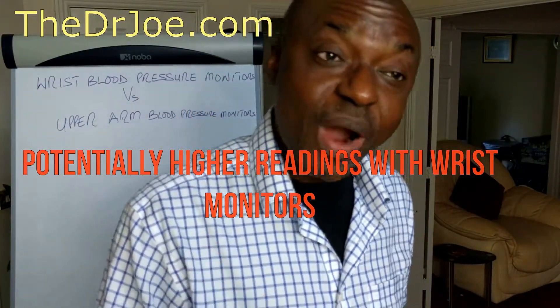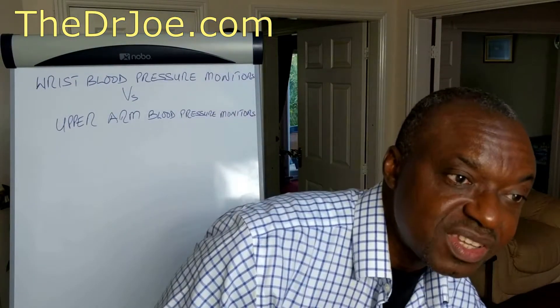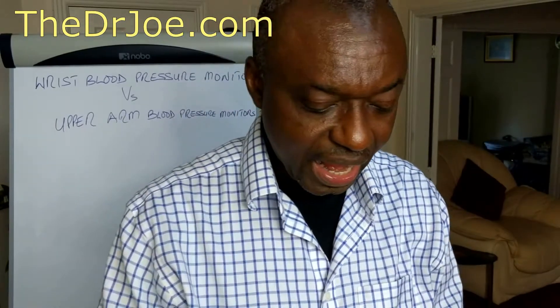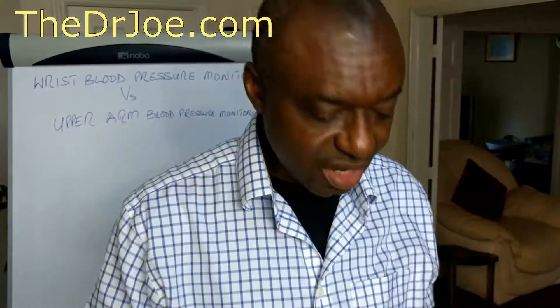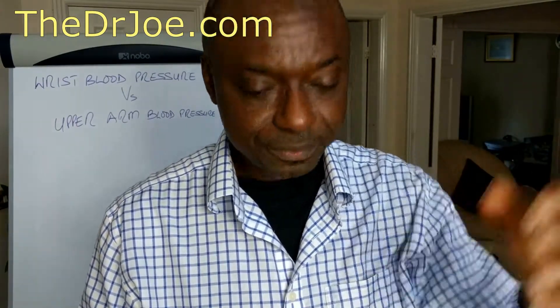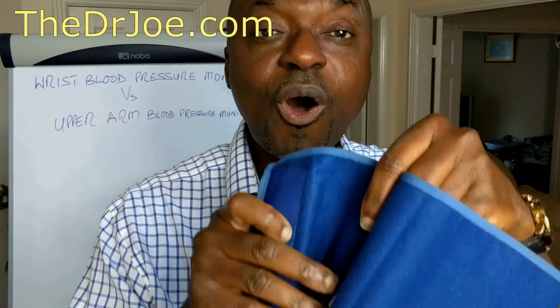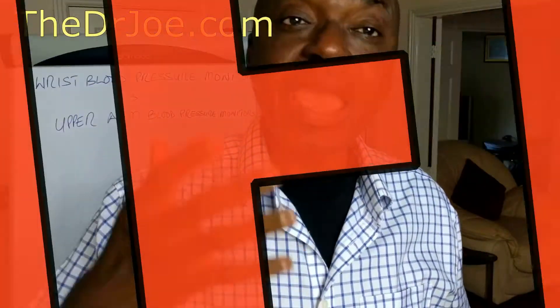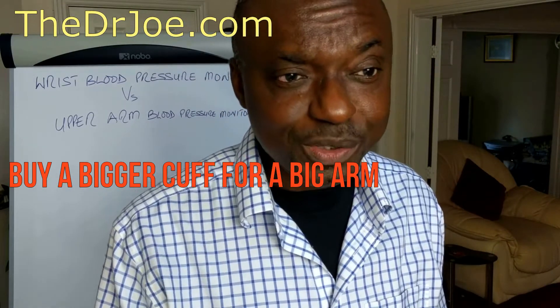It then begs the question: why do people go for the wrist blood pressure monitors instead of the upper arm monitors? One reason is this — some people have a big arm, in which case a regular-sized cuff won't do; it's going to give abnormally high readings. So they go for the wrist monitor because it doesn't require a large cuff. The way around that is to go online and search for a bigger cuff for upper arm monitors. You just buy a bigger cuff — that takes care of that problem.